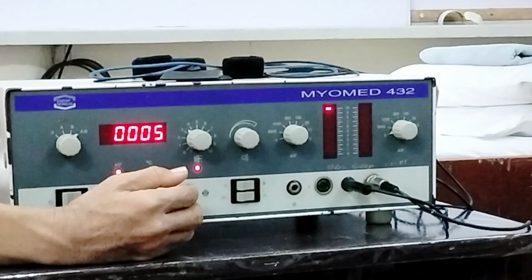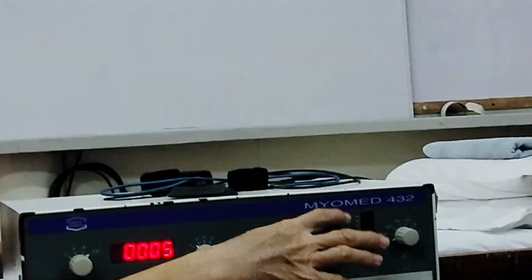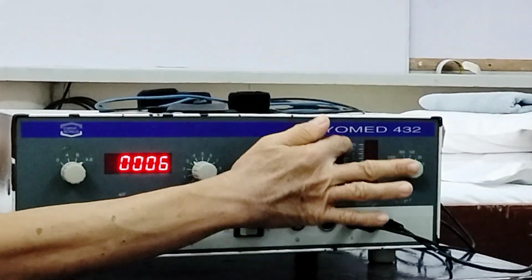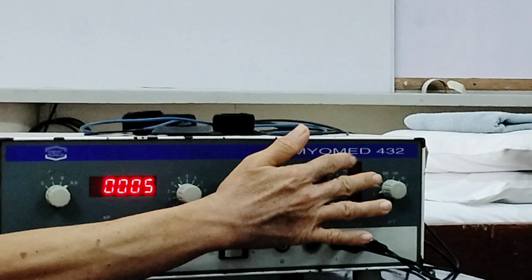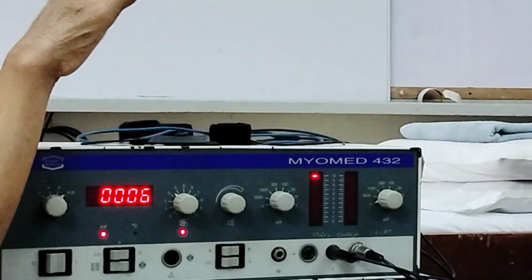Okay. So if we look here, in relation to that, you can see values at the middle, the center. It goes 0, 1, 2, 3 until 10. So that's the level there. This means 10 is the highest level.